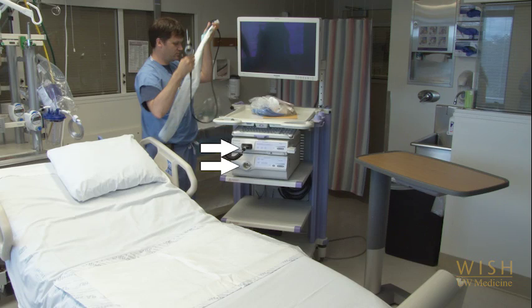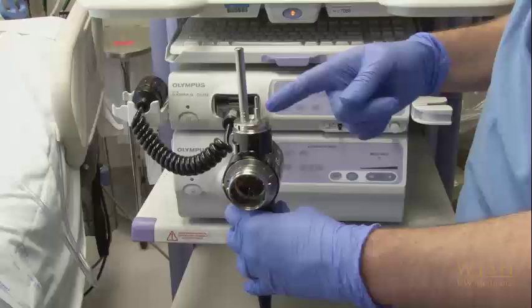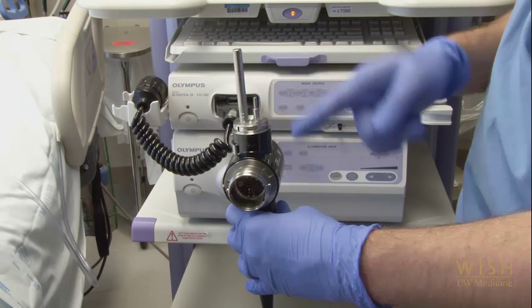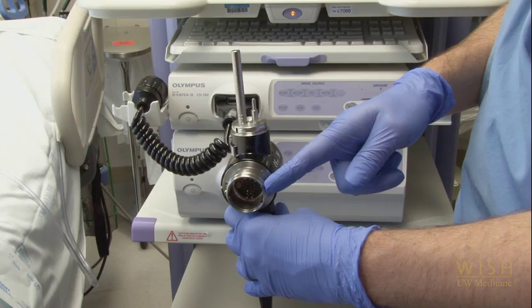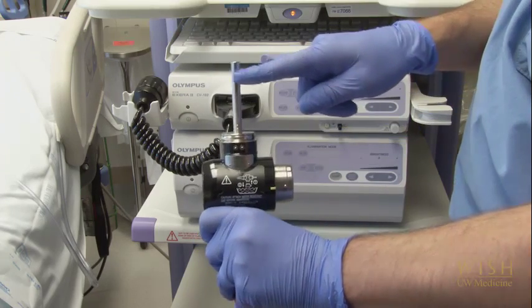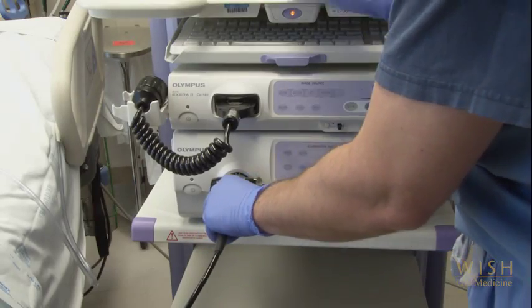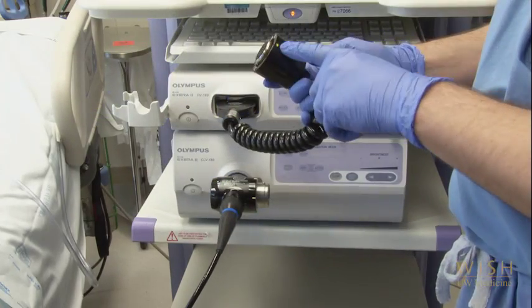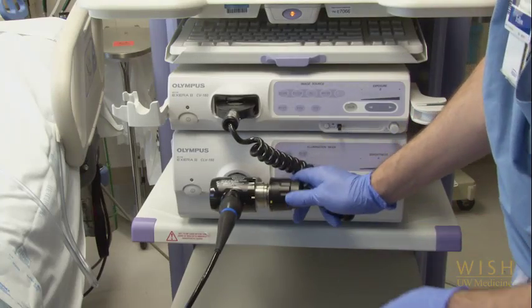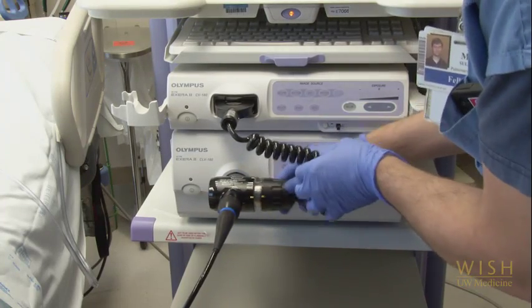Let's watch a close-up of that. The end of the bronchoscope has two rods that insert into the lower unit of the machine. The video card then connects to the larger rounded opening indicated here. Make sure the larger rod is on top as you insert the bronchoscope into the lower unit and click it firmly in place. To attach the video card, line up the dot with the line nearest the bronchoscope cord and twist clockwise until it clicks into the second line.